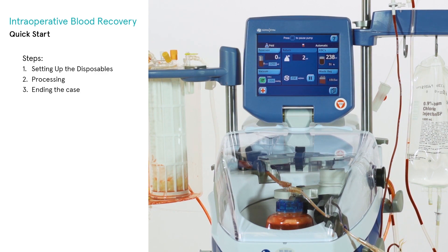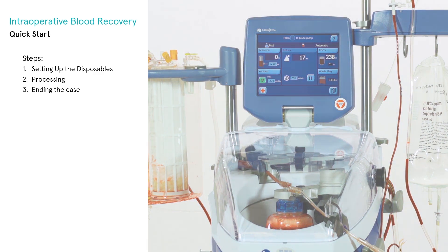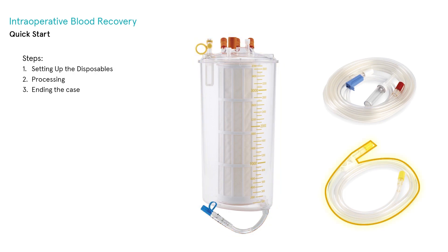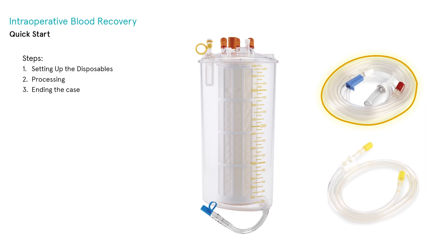To set up the Extra for collection and processing, you will need the following components. A collection set, which includes a filtered reservoir, a vacuum extension line, and an aspiration line.